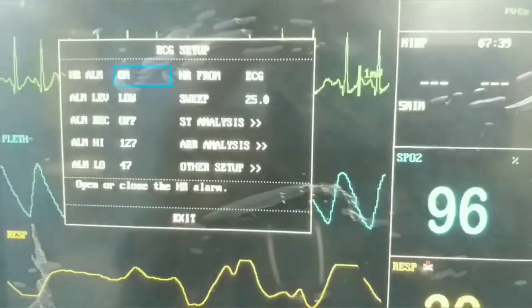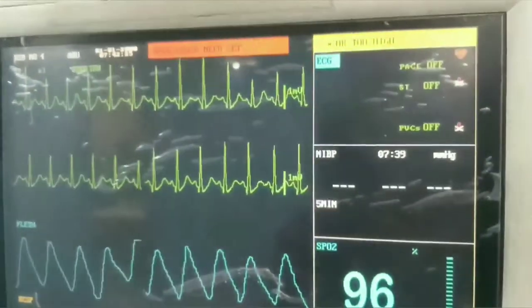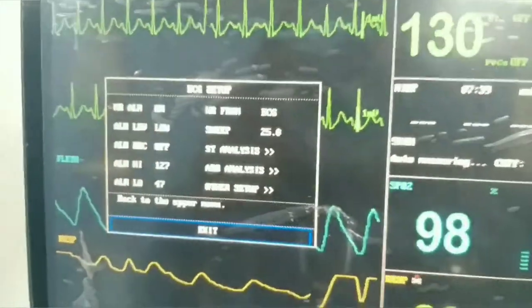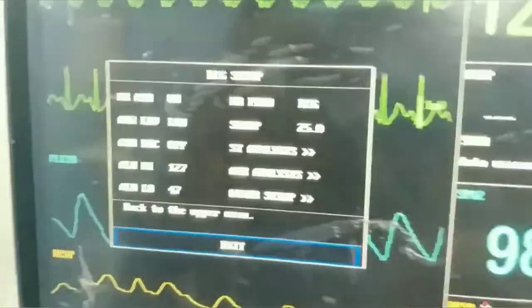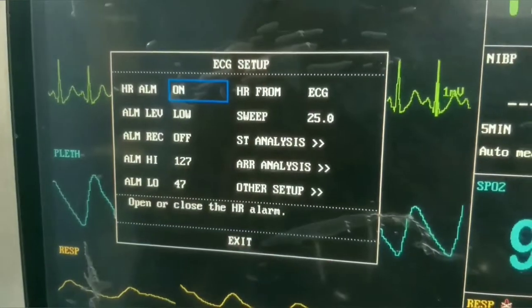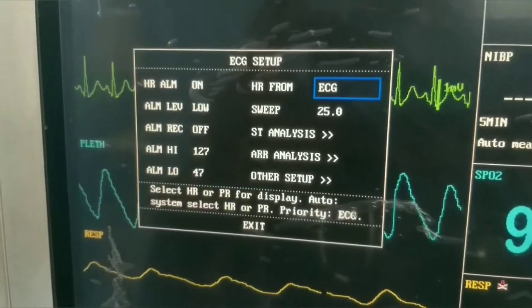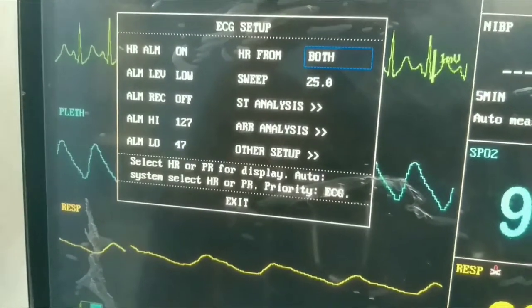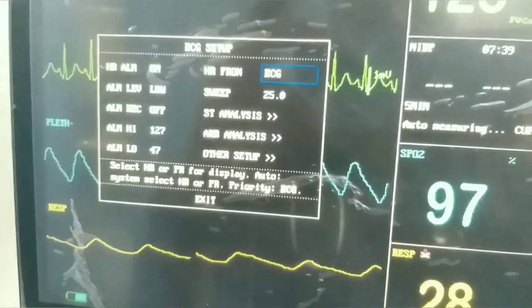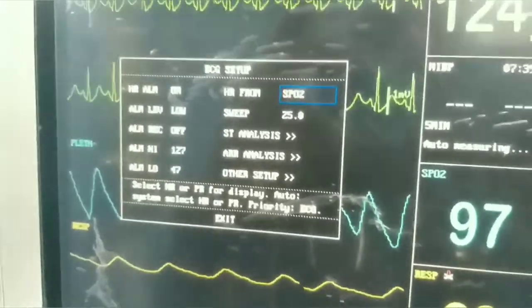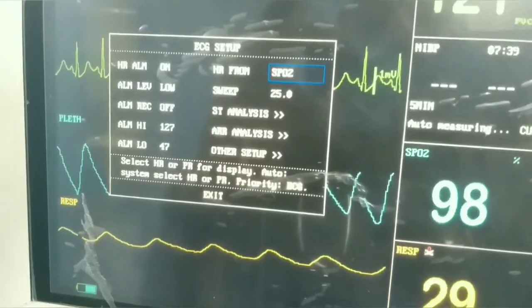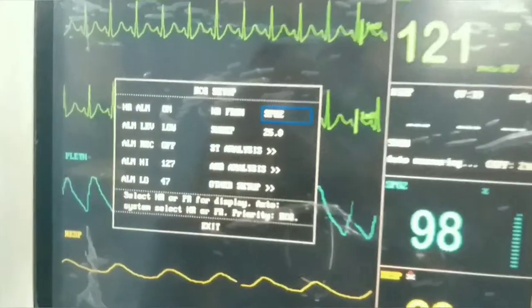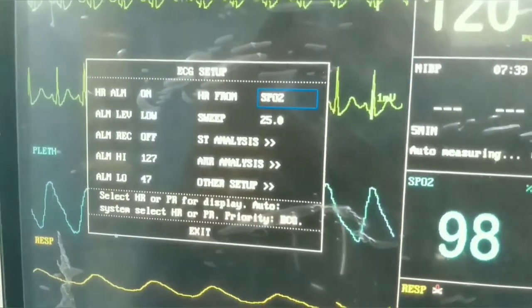We can also adjust from where the monitor records the heart rate — either from the ECG or from the SpO2. Sometimes if a patient is shivering, irritable, or we are doing cold sponging, we may need to remove ECG leads and monitor heart rate from the SpO2 or pulse oximetry probe. So in this setting we have both options.